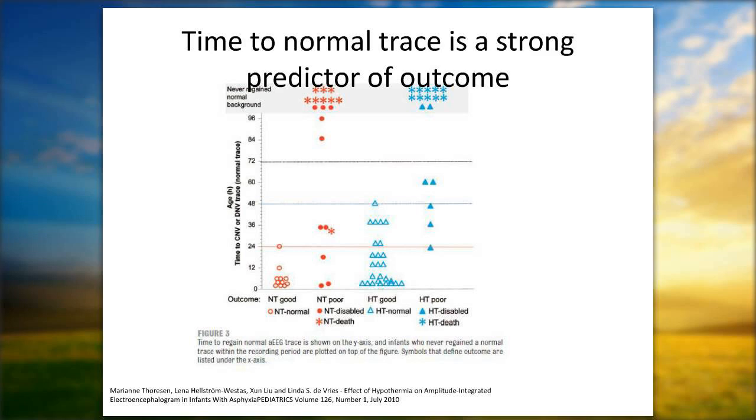And I think that with aEEG, and especially during HIE, we want to have that continuous review by the bedside team, and we don't want to miss the opportunity to intervene more quickly and to recognize very subtle improvements that we might see in our kids around that 24 to 36 hours.